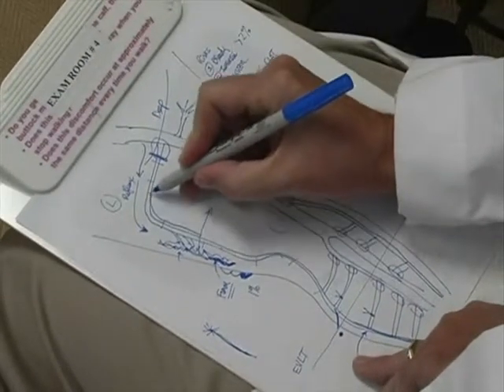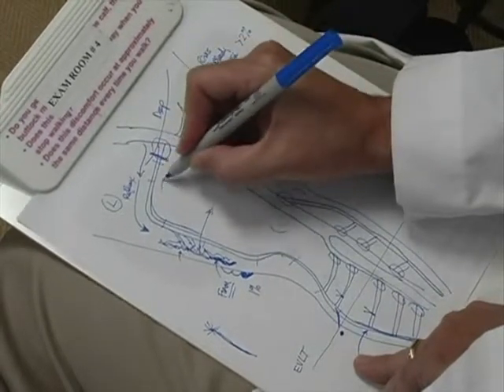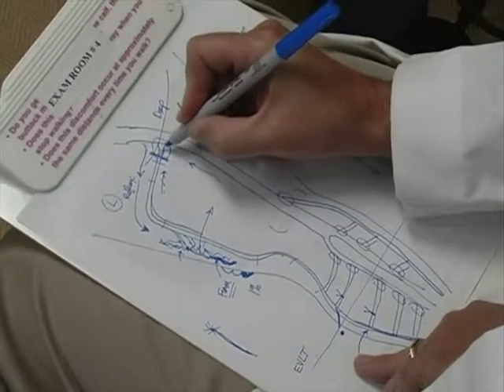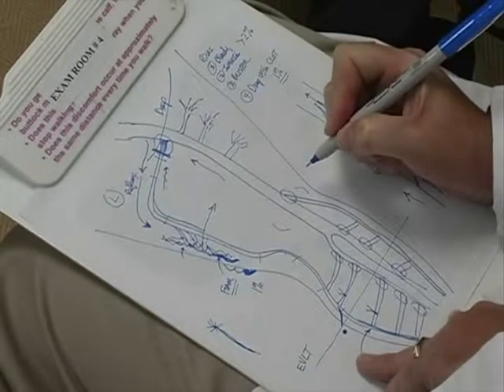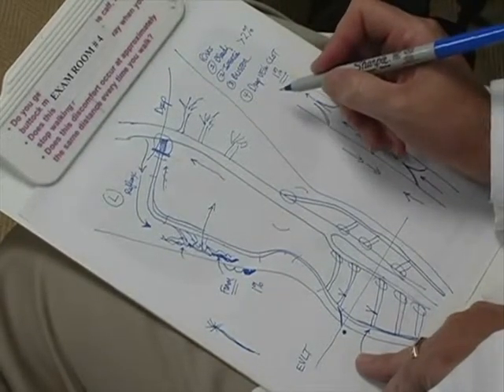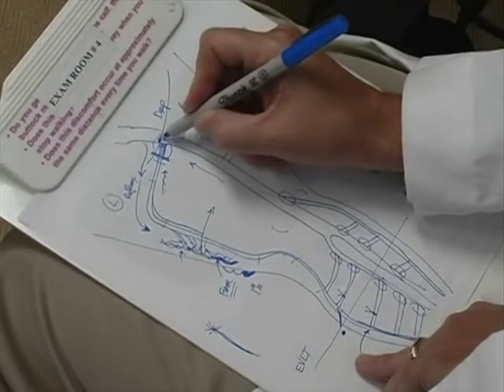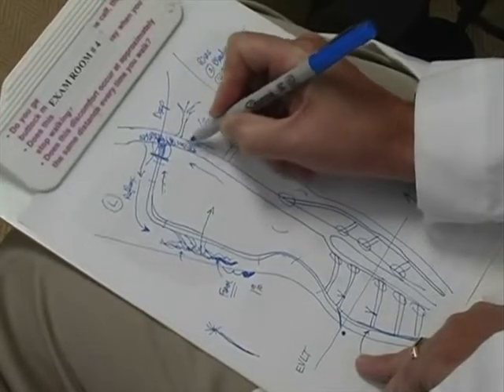When we laser this vein closed, the blood flow through this area is no longer present. The body will naturally clot this vein all the way up to there. Some people have abnormal clotting properties. Their body doesn't know when to stop. They will continue to clot until they get clot out here into the deep system.